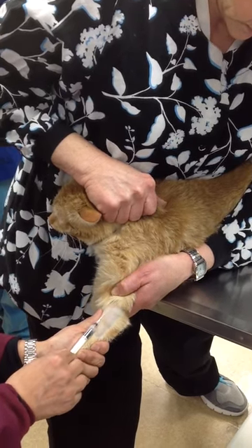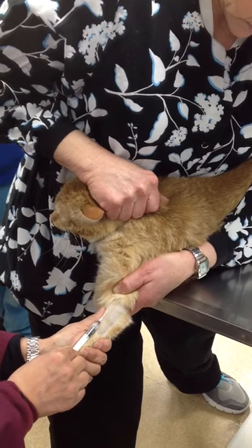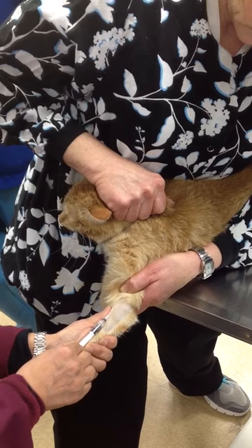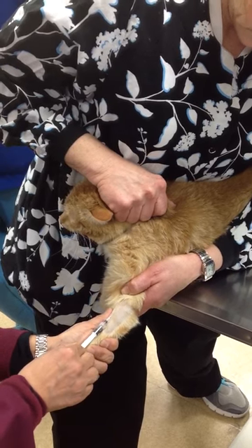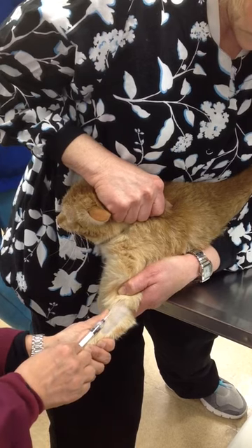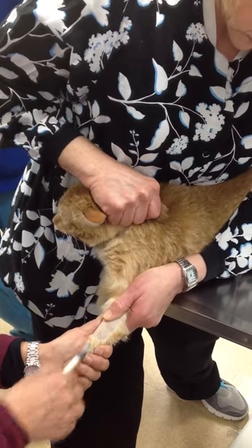Very slowly pulling back on the plunger, try not to collapse my vessel. Unocclude, cover, and come out.